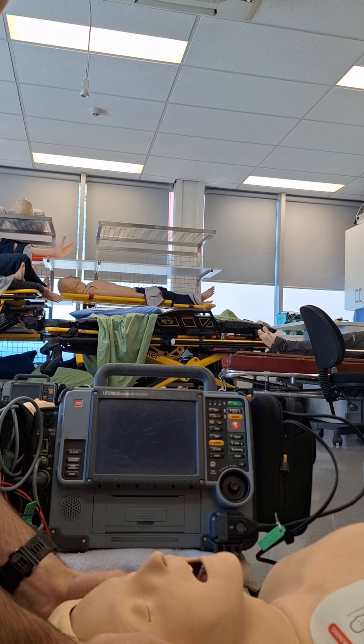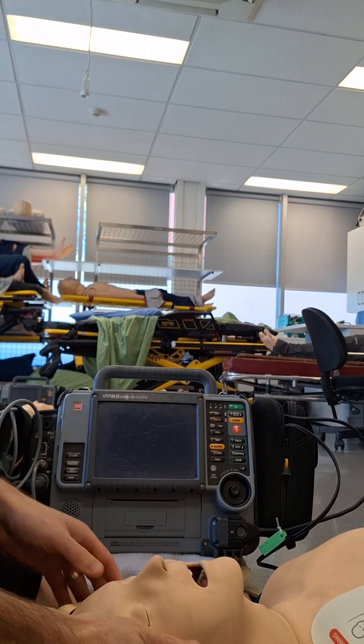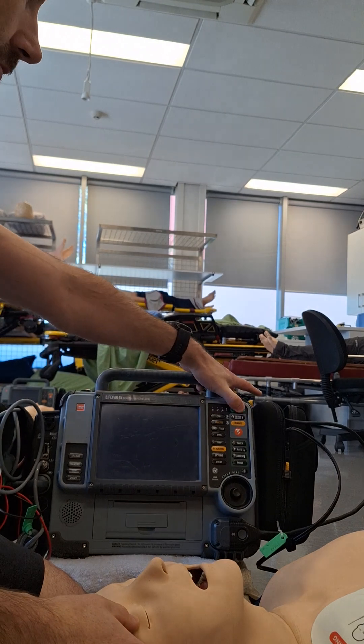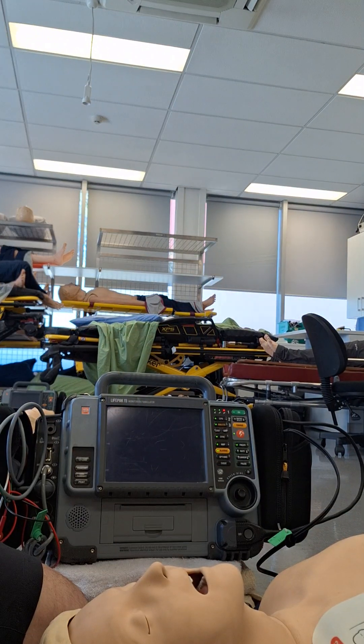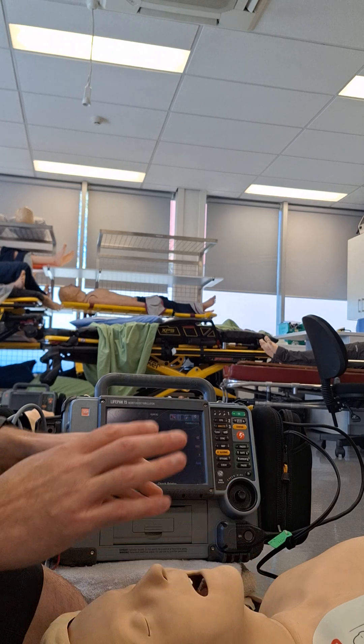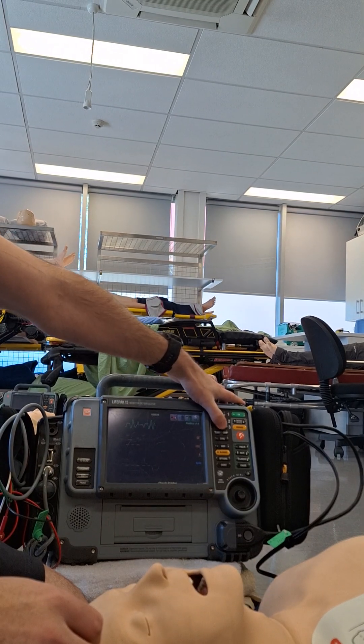All right team, this is a summary of using the LifePak 15 monitor for your resuscitation. So we'll turn on the monitor and we'll attach our pads. Once we've got our pads in place, we can push Analyze.